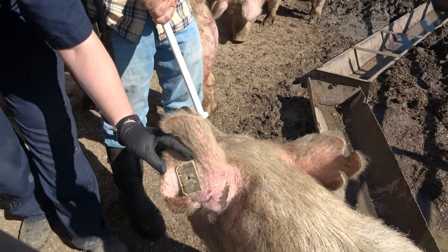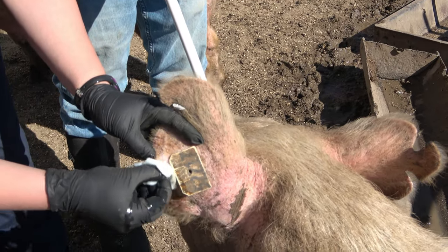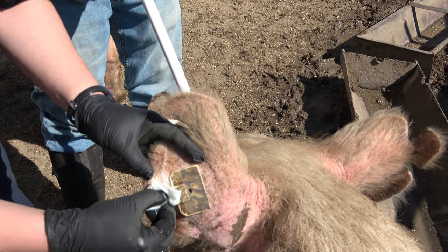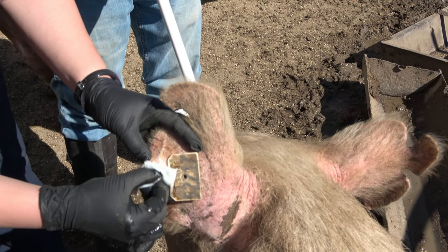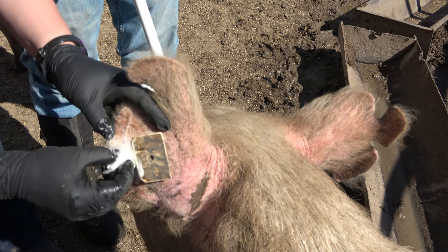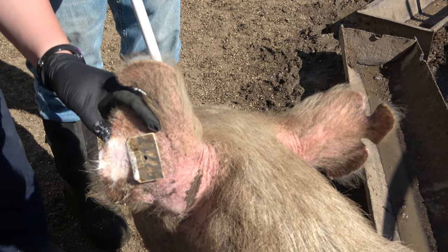I usually like to use right ears in pigs because I'm right-handed and that works a lot better for me. But this sow has been numbered on her right ear, so I don't have a lot of space to work with on that one. So we'll put the catheter in her left ear today.